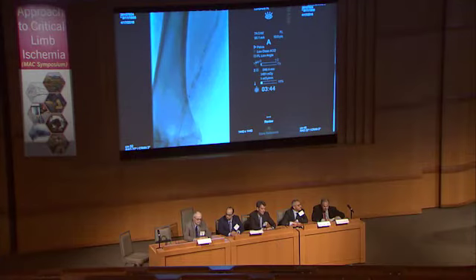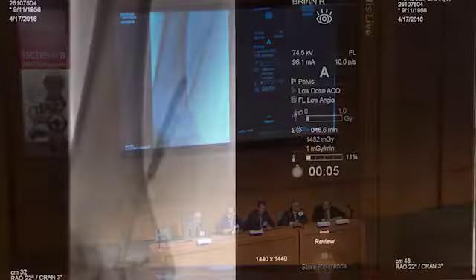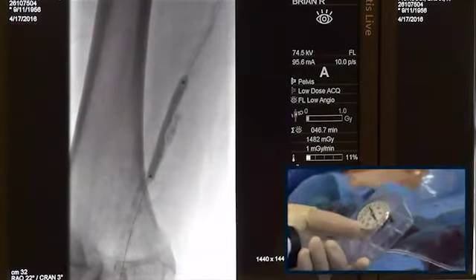The remaining SFA I would simply treat with drug-coated balloons, and for the origin you might need a short stent in addition. Tom, have your results with drug-eluting balloons been good in this kind of calcium? Well, this area will not respond to drug-coated balloon. No, it's a mechanical problem, but everything proximal to that will.